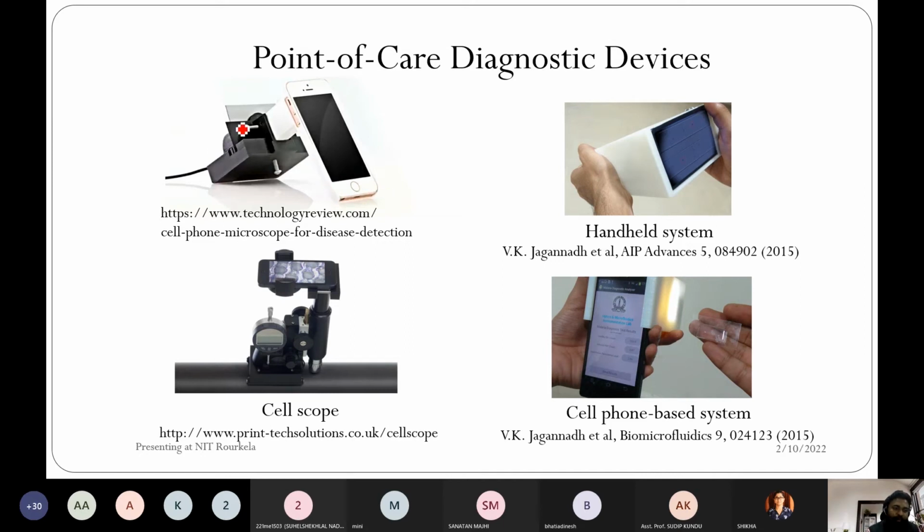So basically you would be preparing a malaria microscopic slide and visualizing it with the help of a cell phone camera, so you can find the different morphological features. Again, you need to prepare the microscopic slide, visualize it, and develop an algorithm which can identify the morphological features. Again, the limitation here is that throughput is challenging.